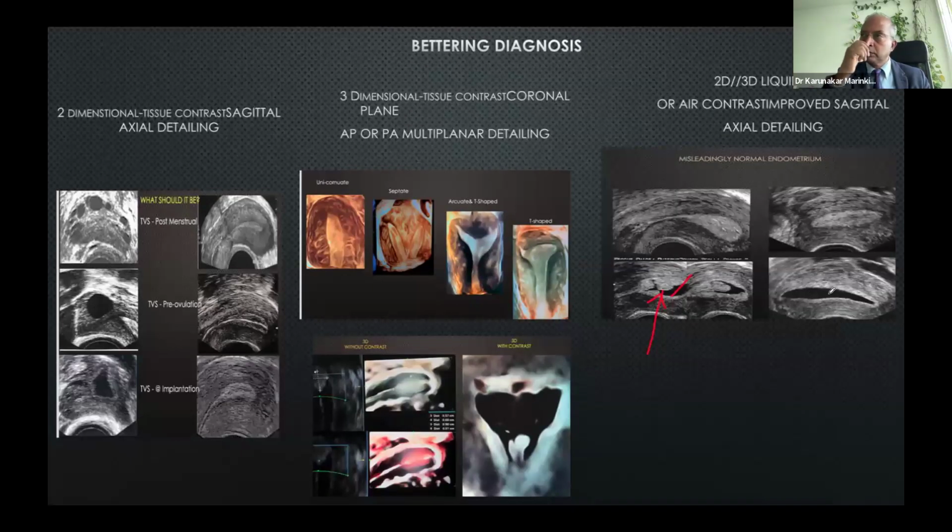So I can quote the Center for Reproductive Medicine, CRM London, which has been in the top 5 centers for highest clinical pregnancy rate in the UK for a number of years. They do universal 3D contrast ultrasound before first embryo transfer, and they published a 13% excess pregnancy rate at the British Fertility Society conference. On the same note, if you're doing universal hysteroscopy even before the first IVF, you have a minimum 25% excess live birth rate. So waiting for things to go wrong and then doing the 3D scan and then hysteroscopy needs to be abandoned, according to my experience.